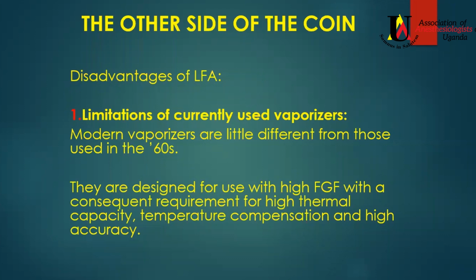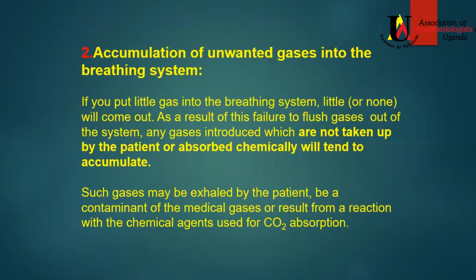So a lot of people are skeptical. And this is where having a gas analyzer comes in very handy, because it can help you see exactly what you are delivering to your patient.